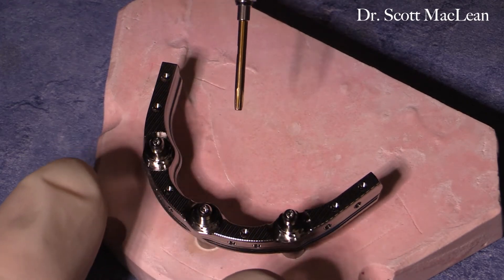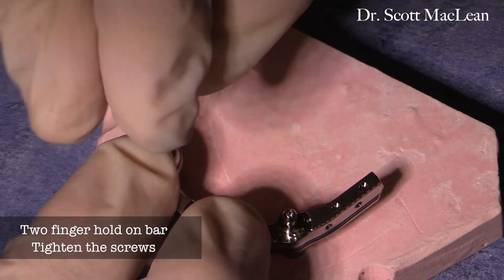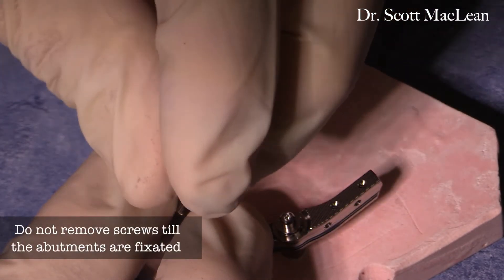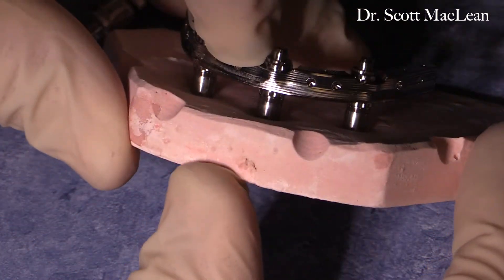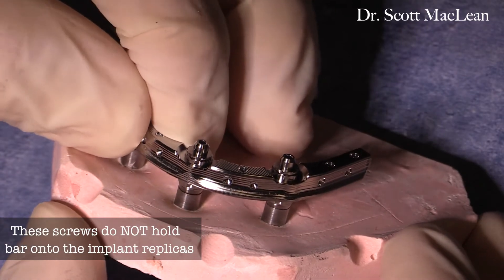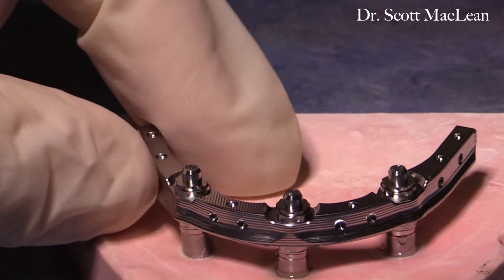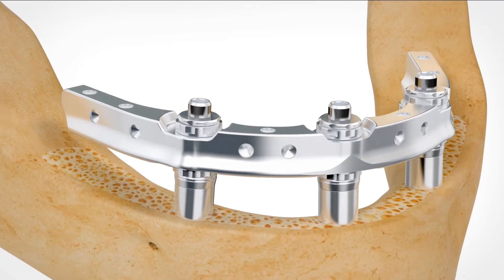We're going to use two fingers to hold the bar over the three implants, then tighten down the uni-grip screws — the abutment compensating screws — so that the bar passively fits on the implants. The goal at this point is not to have the bar attached to the replicas, but rather to use the compensating screws to fixate the abutment itself, as there are many components in the abutment. We can hold it down with finger pressure to check, and also take it off since it's not screwed into the replicas. I like to try it on multiple times just to make sure it is passive on the replicas.